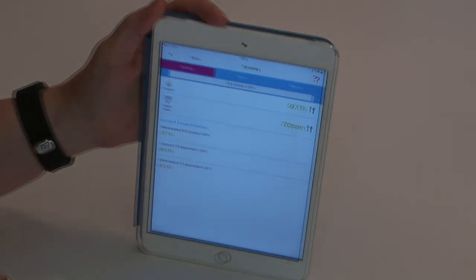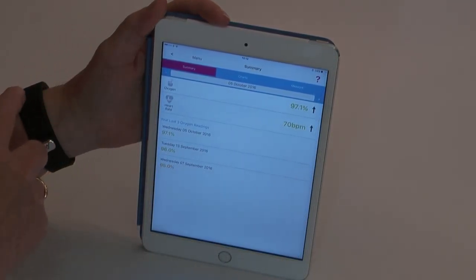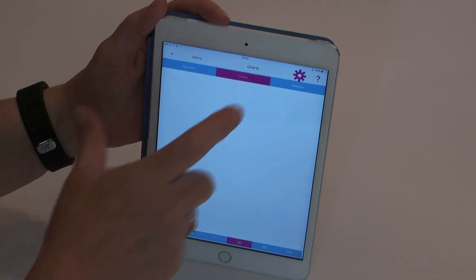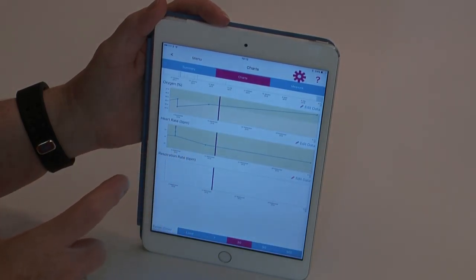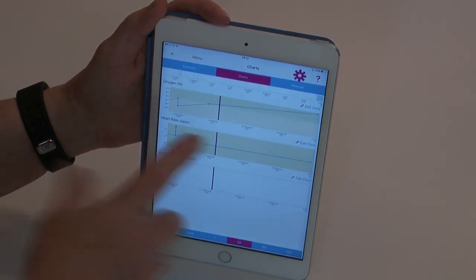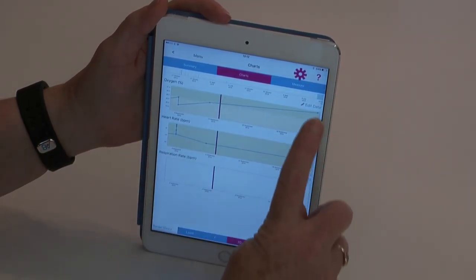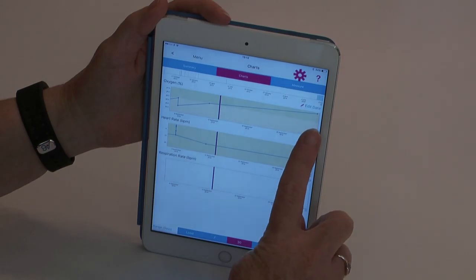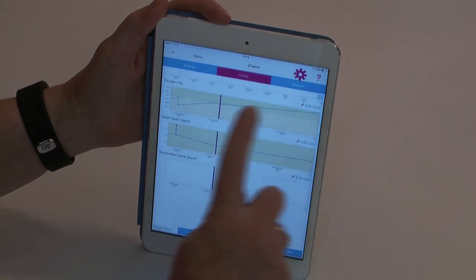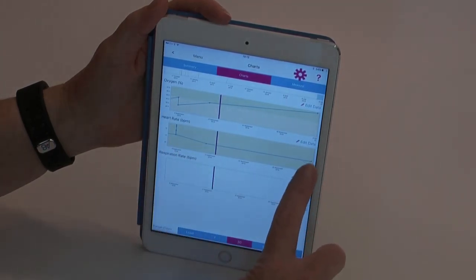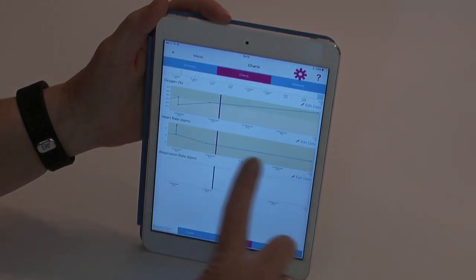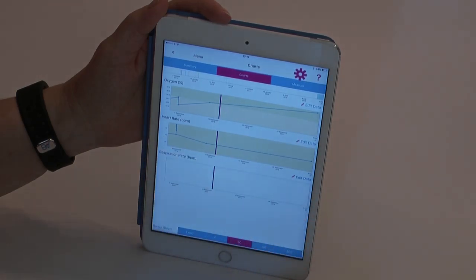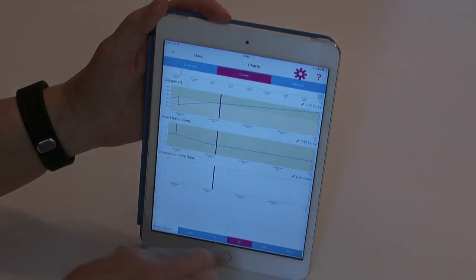To view your data in the charts, you can press on the charts part of the menu and you can see your data over time. Here it is for 30 days, and you can switch to 90 or 365.